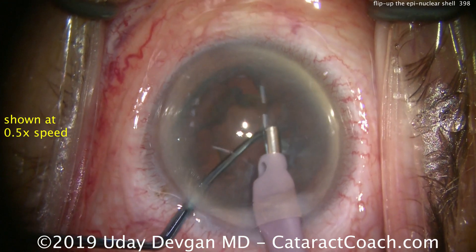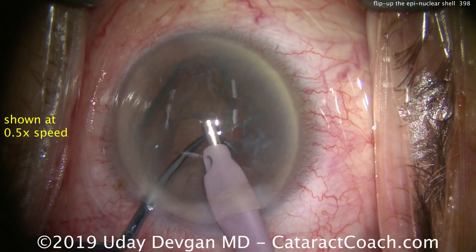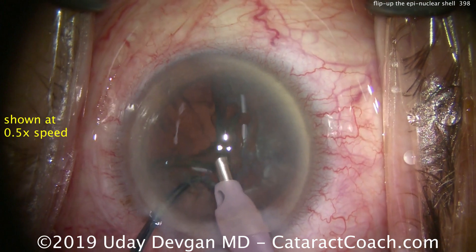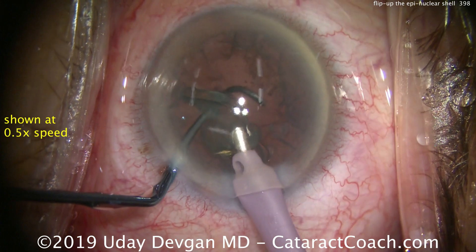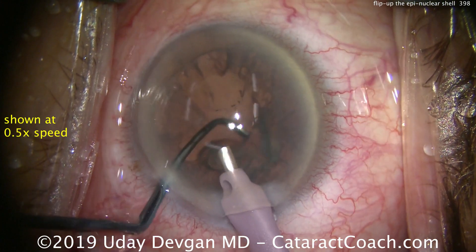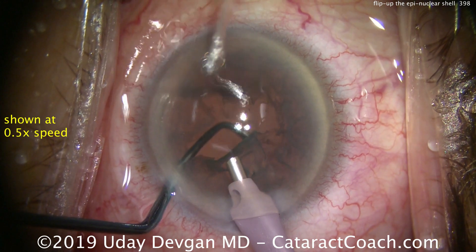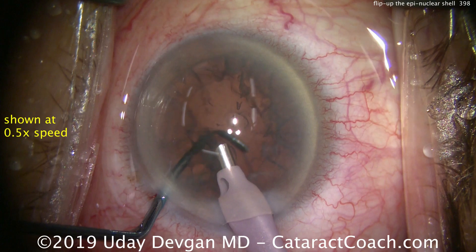Low vacuum, foot still — we're going to barely grab onto the shell. Once we get that shell, the chopper is pushing it and flipping it up. The whole thing comes up to the iris plane; we can aspirate it. The chopper is still there in the protective position to prevent the posterior capsule from coming forward.